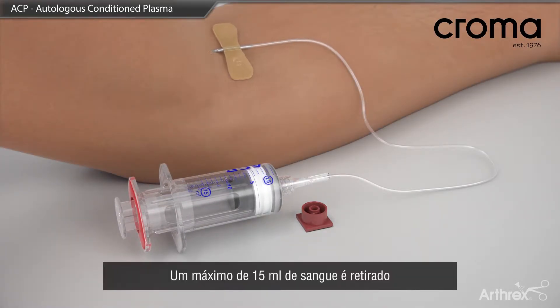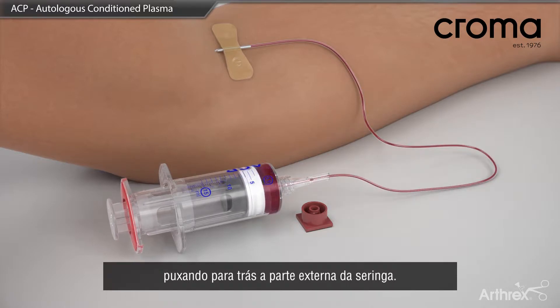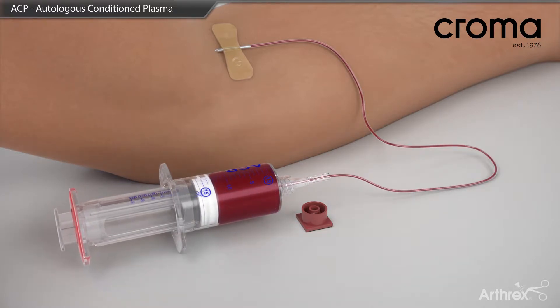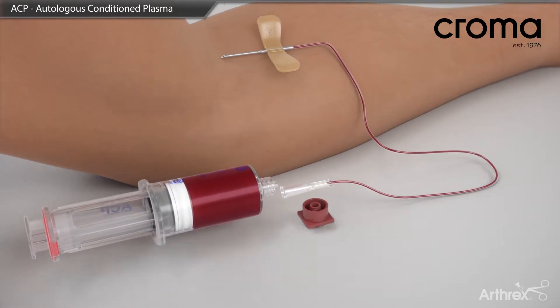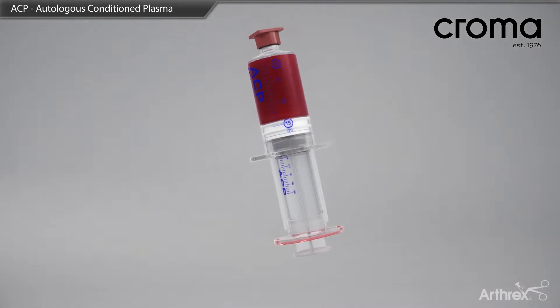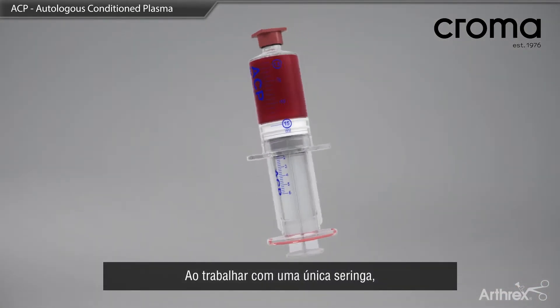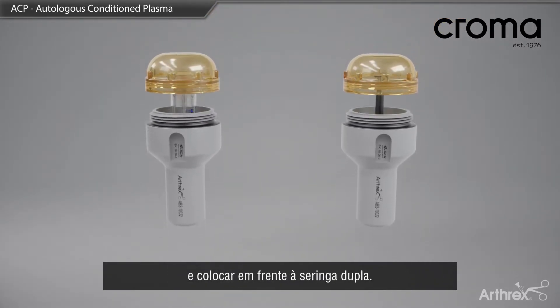A maximum of 15 cc's of blood is drawn by pulling back on the outer portion of the syringe. When working with a single syringe, you must use a counterbalance for spin and place it opposite the double syringe.